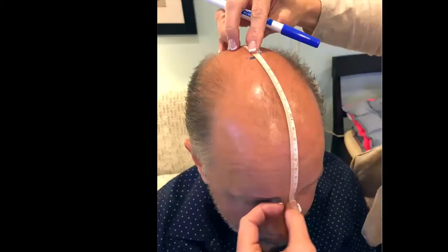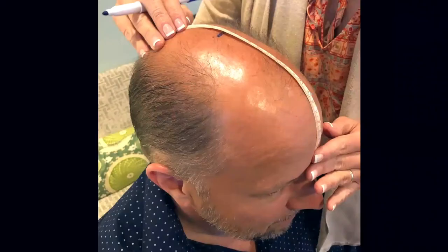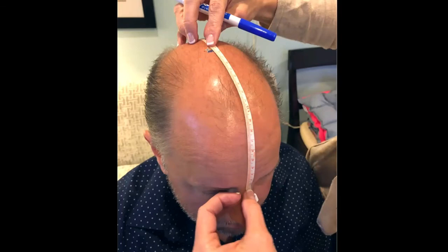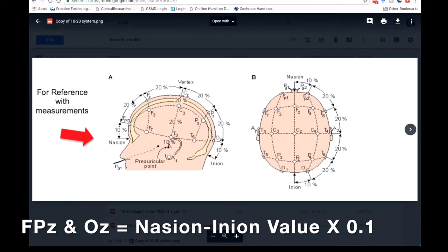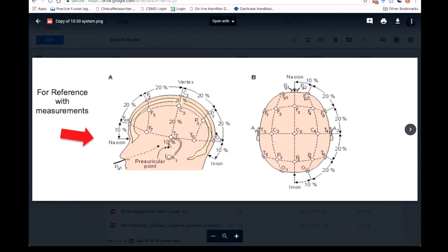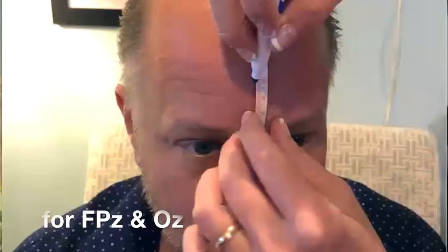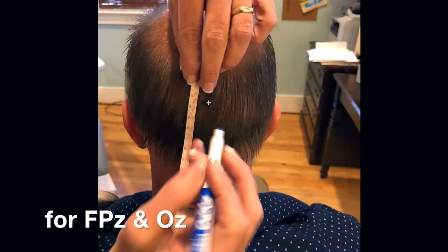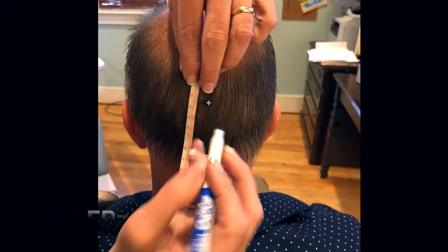Here you will see us marking CZ on the patient's head with a dry erase marker. It is also helpful while your measuring tape is in place to multiply the nasion to inion value by 0.1, which will allow you to get two important points of information needed for the circumference of the head — specifically the frontal polar 0 (FPZ) and the occipital 0 (OZ). These marks are used for the circumference measure later and are also very helpful when marking X. You'll mark 10% of the nasion to inion value as FPZ, and 10% up from the inion in the back as OZ.